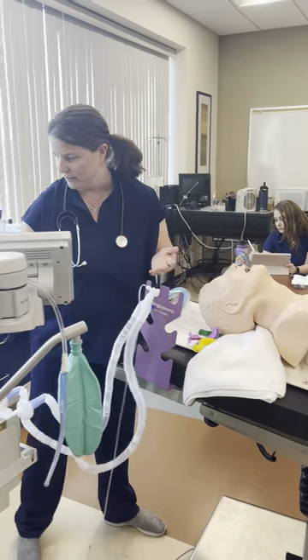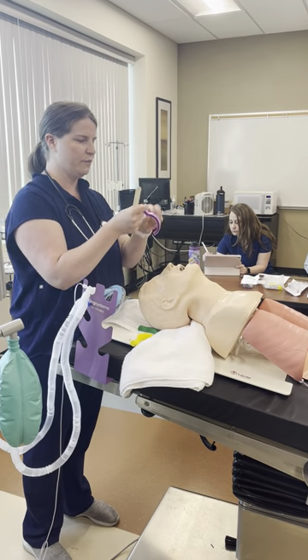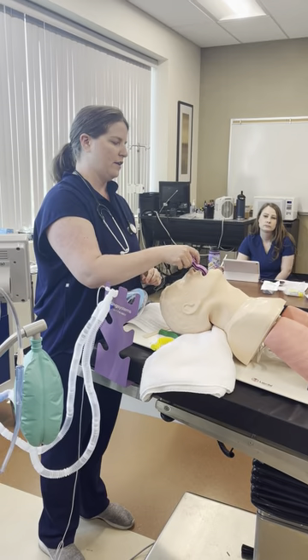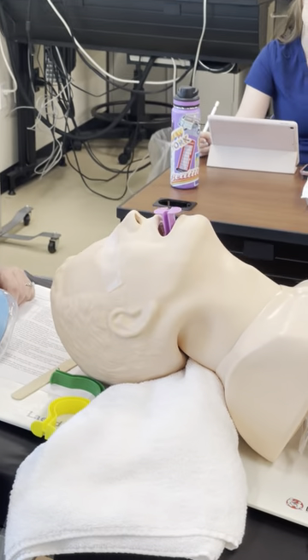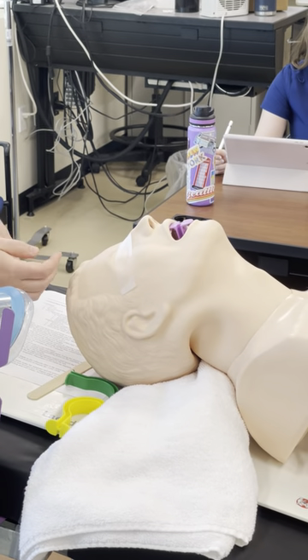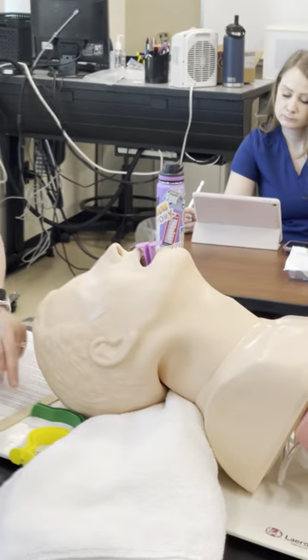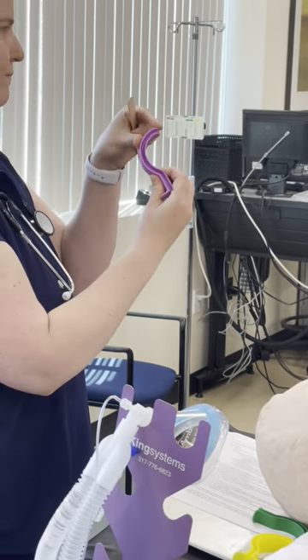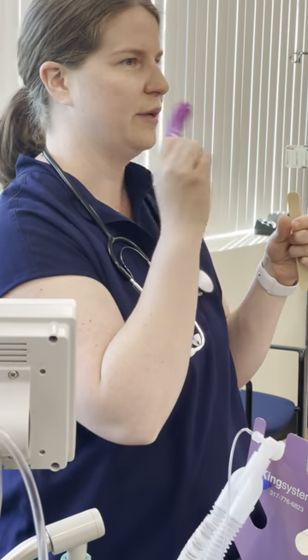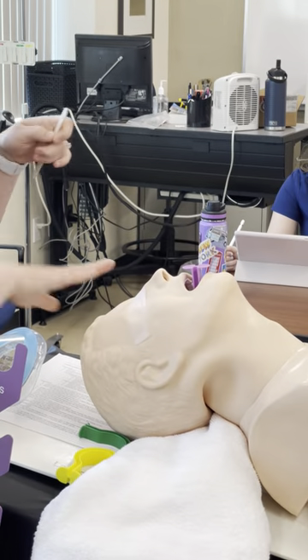If the patient has sleep apnea and you can't ventilate, there are two ways to place an OPA. One method is to insert the OPA backwards then flip it 180 degrees halfway through — the flange should sit above the lips, not on them, to avoid causing fat lips. The method I prefer is using a tongue blade to displace the tongue and slide the OPA straight in — super simple.